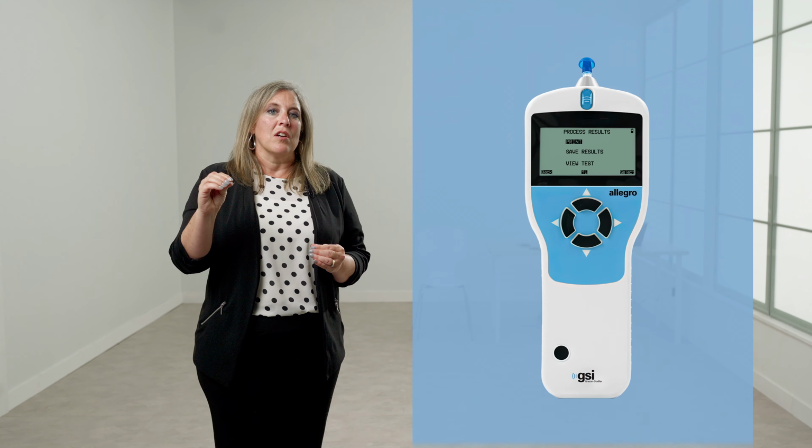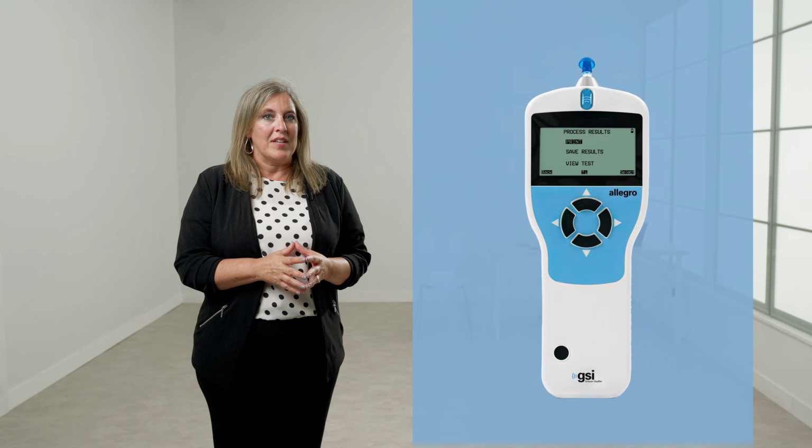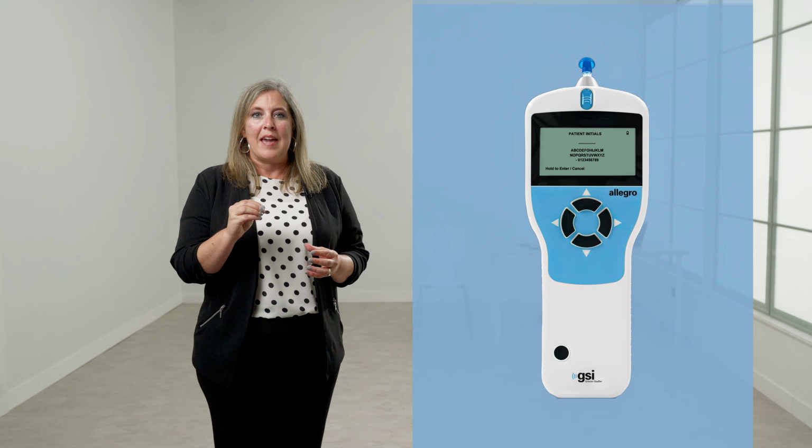To save the results of a test, select Save Results from the Process Results menu that is displayed on completion of a test. A 3-character identifier is used for the record. This is also used as the reference for the patient's name on the printed record and for data transferred to a computer. To enter the identifier, use all 4 navigation buttons to select the characters.